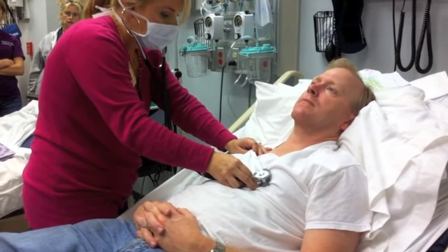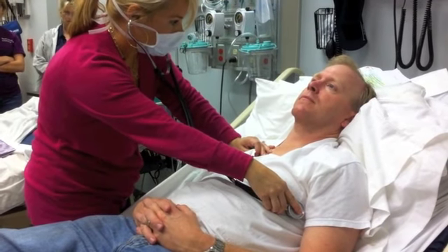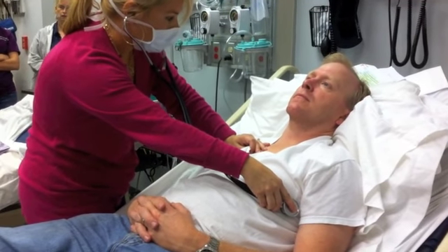So we do it with the diaphragm and then with the bell? And then if we have a scope that doesn't have both sides, we just tell you we're pressing harder?